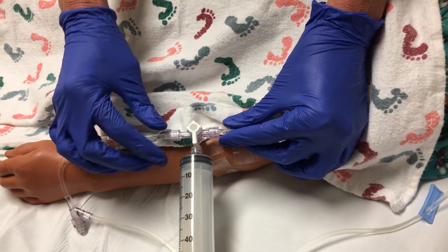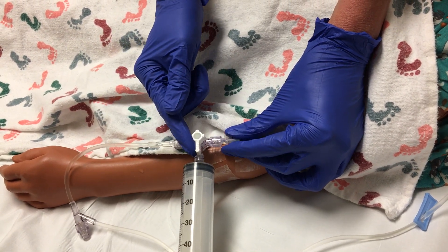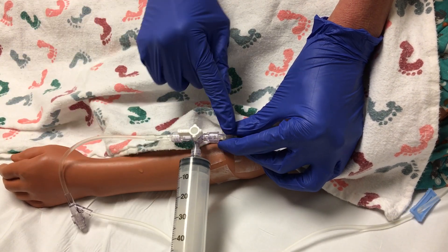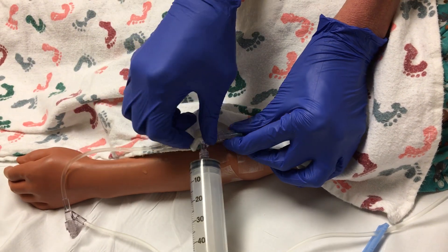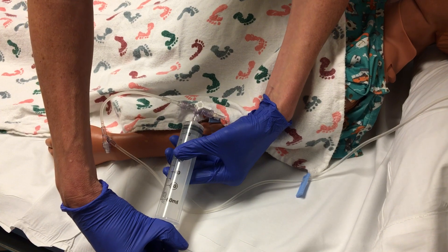The important thing to remember about the stopcock is wherever this white toggle is pointing the channel is off. So if I'm off to my fluids I'm on to my patient and vice versa. In order to do the pull push method we're going to be off to our patient first to allow us to withdraw the fluid from the IV bag.